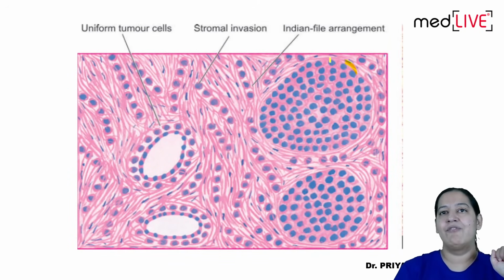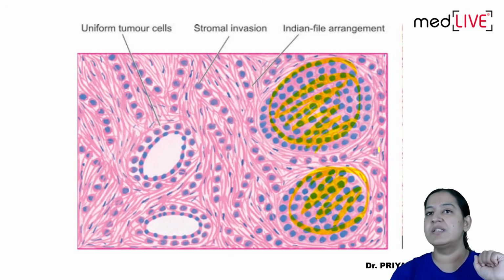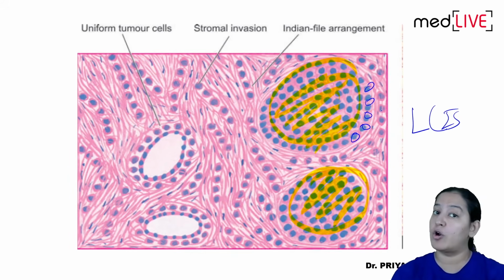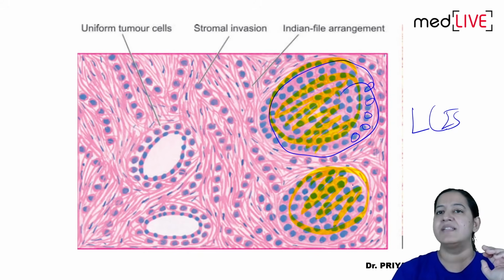Listen. So this is what it is. What are these two structures? You can say, ma'am, it is in situ. In situ, which in situ? It is lobular in situ. So just a second. It is lobular, LCIS, because the cells are loosely cohesive. It is solid pattern, but solid was its only pattern. LCIS had only one pattern. So it is a lobule and it is LCIS.